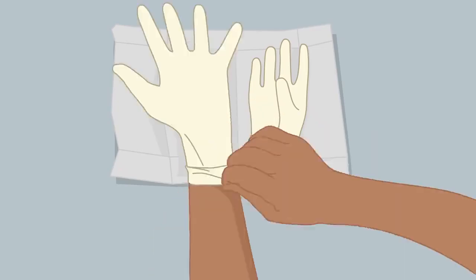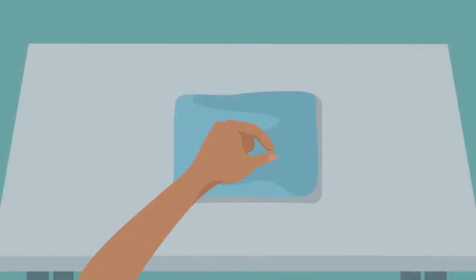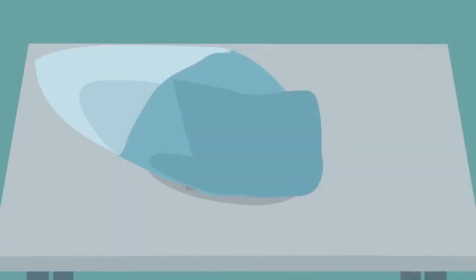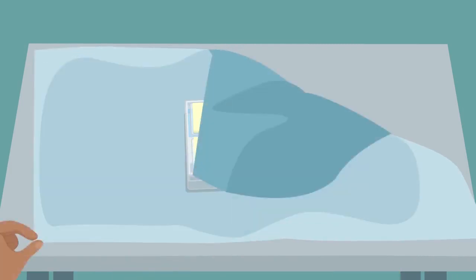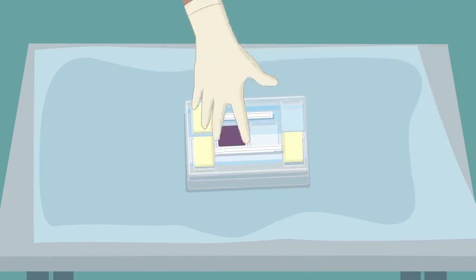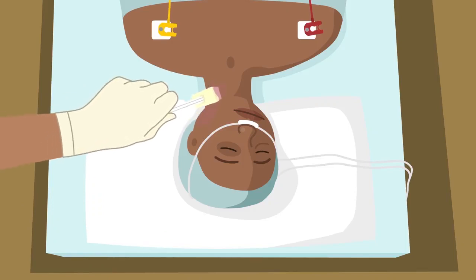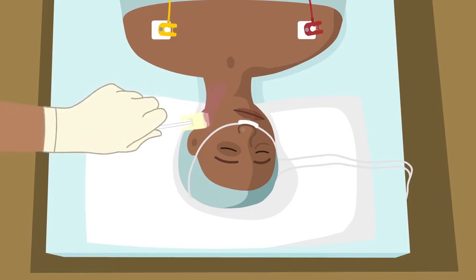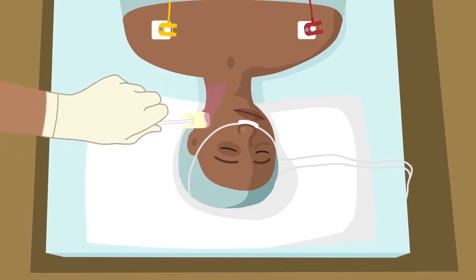The physician puts on sterile gloves. The insertion kit is prepared using an aseptic technique. The assisting nurse prepares the skin disinfectant. The skin antiseptic is applied by moving the applicator back and forth for at least 30 seconds, starting at the catheter insertion site and then extending to the entire work area.